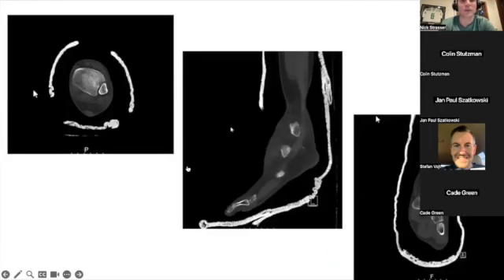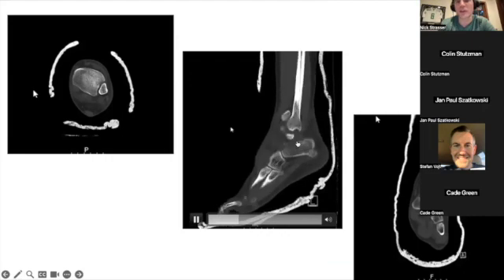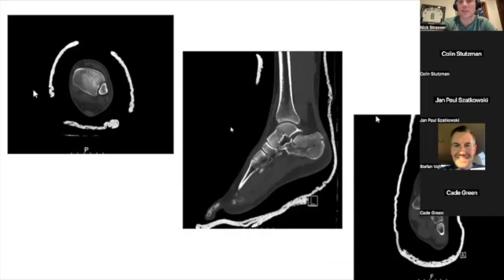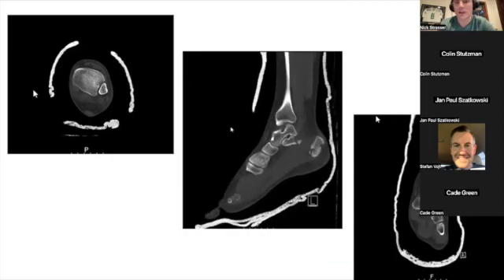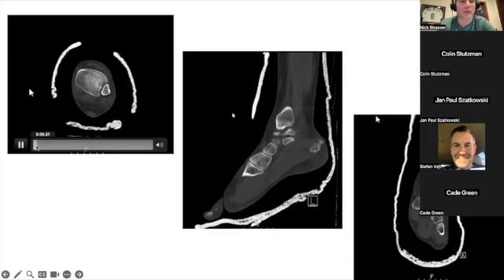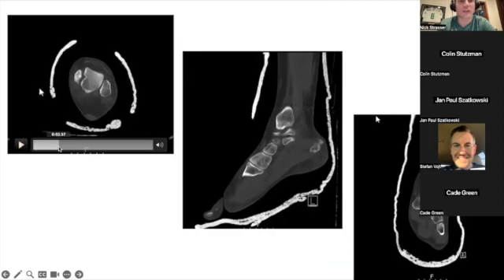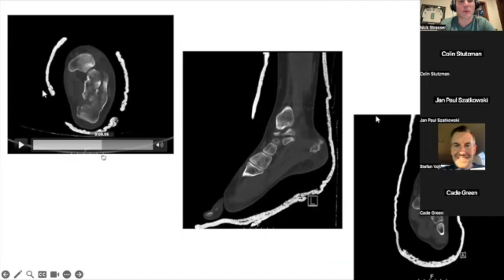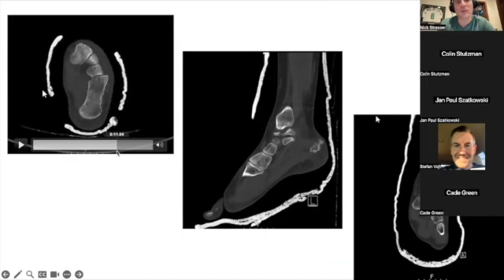Here are his views. His coronal here in the middle — or sorry, sagittal coming from the side. You can see that piece is attached to that tuberosity fragment there. It's kind of depressed and getting a little dicey. Here is his axial view. You've got the lateral wall there, not a ton of deformity in terms of varus and valgus, which is fairly common with these.